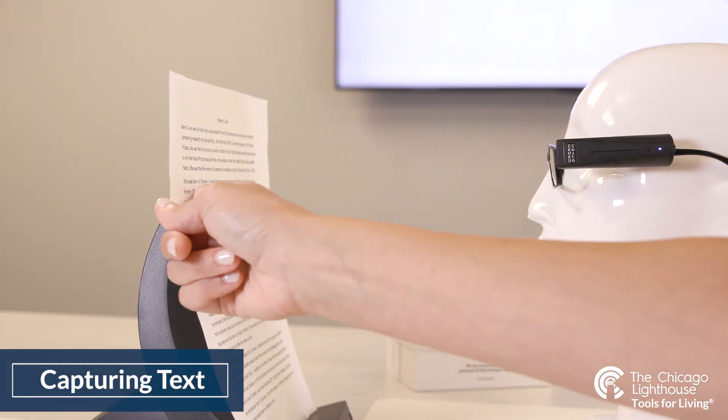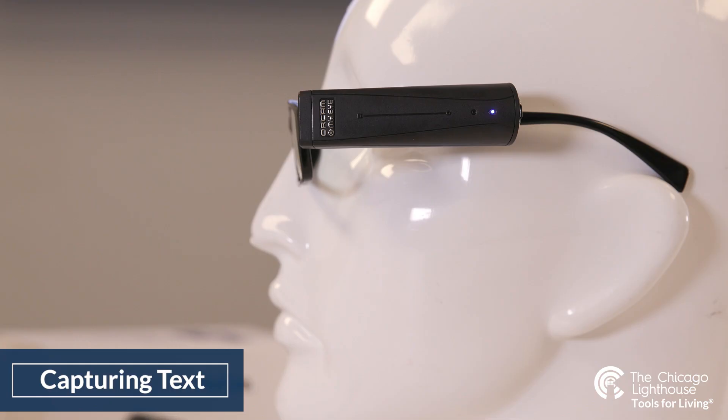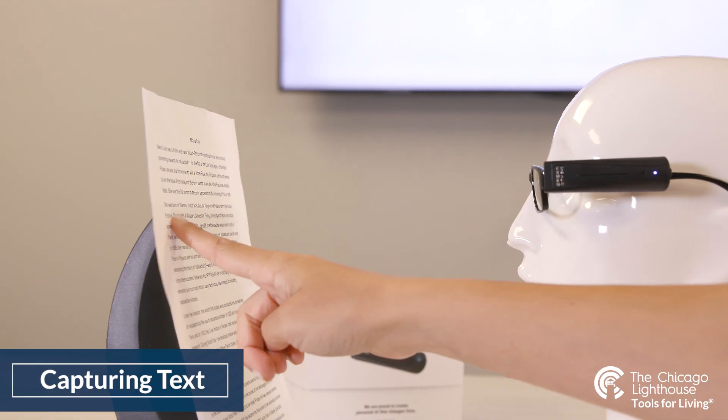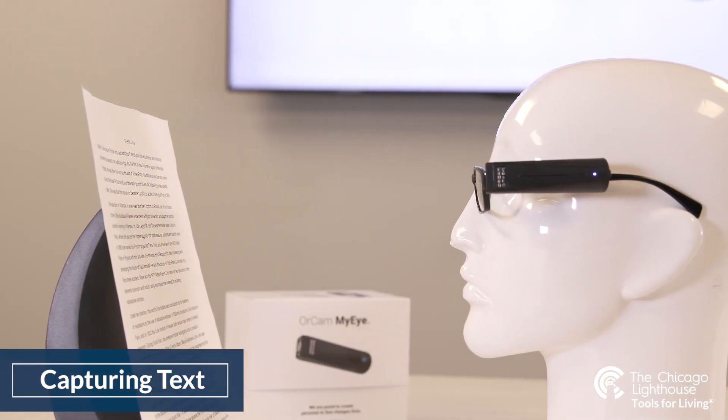The second method of capturing text is for reading specific areas of text. You can do this by pointing your index finger at your text — your nail bed must be shown to the device, as this is how it detects where the finger is pointed. Once you have placed your index finger parallel to your text with the flat of your finger against the page, hold it in place until you hear an initial chirp. Once you hear the sound, keep looking at your text but remove your index finger. Another chirp will sound, signaling that the full photo of your text was taken.